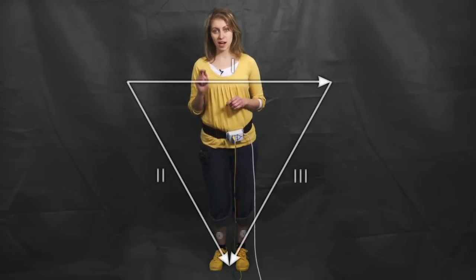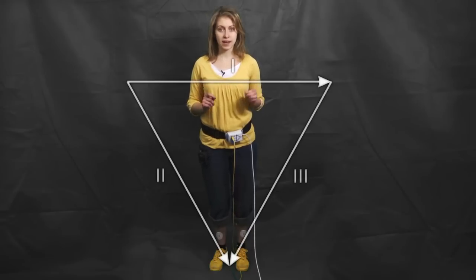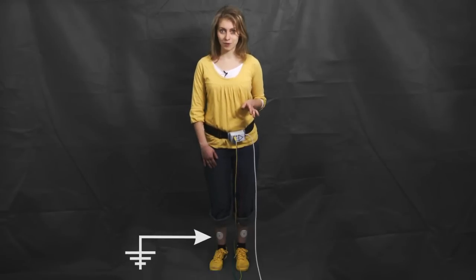The tip of the arrow indicates the positive and the opposite end the negative input. And ground is always connected to the right foot.